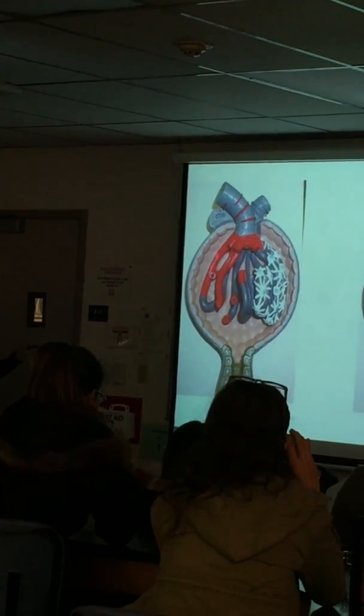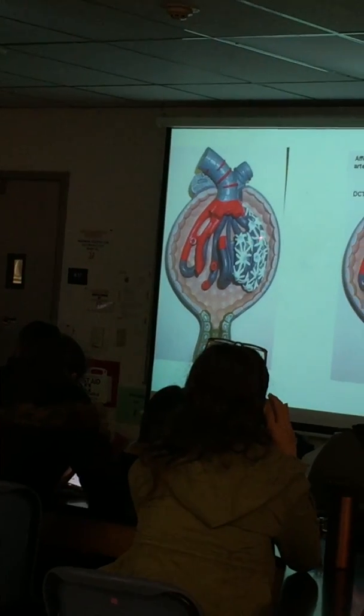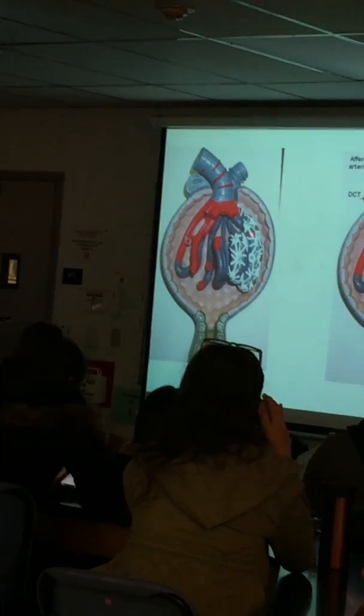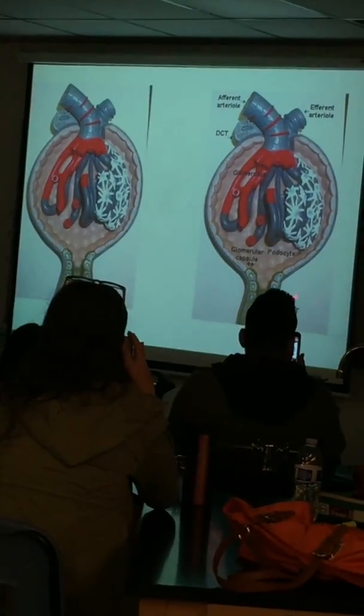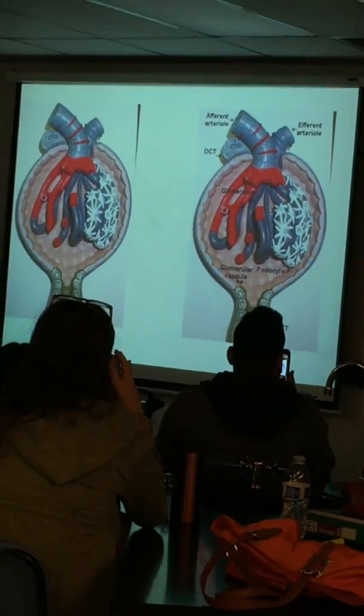There's the glomerulus, and then we can see the visceral layer of the Bowman's capsule, and we see the podocyte cells, the foot processes form the filtration slits. So you can call this tubular pole, or as they call it, the PCT, the vascular pole here. And yeah, that's it. That's all I got. That's all the slides I pulled. So now I'm done with the review.